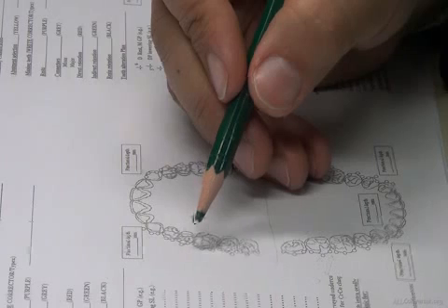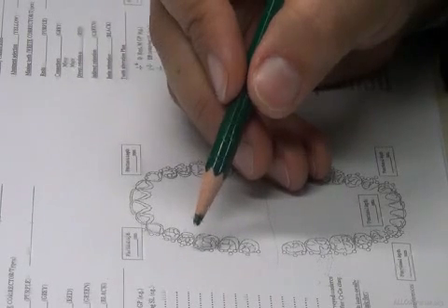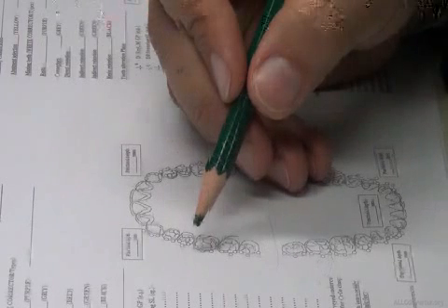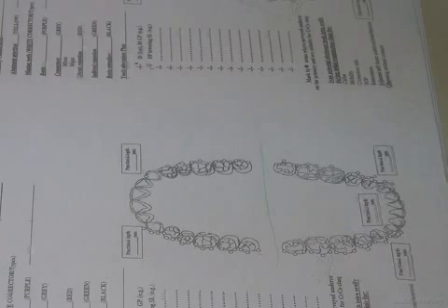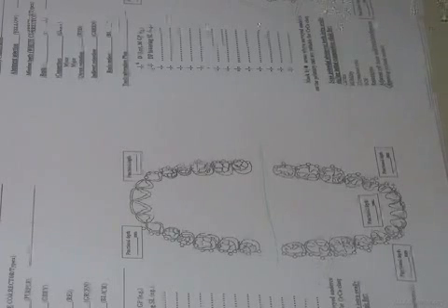What is a suitable undercut? Let's go back to the definition. What is the suitable undercut? A suitable undercut is where I want to end my clasp suitably to serve all of the biomechanical principles. Okay? It has relations. Try to imagine it in 3D. It has 6 relations.